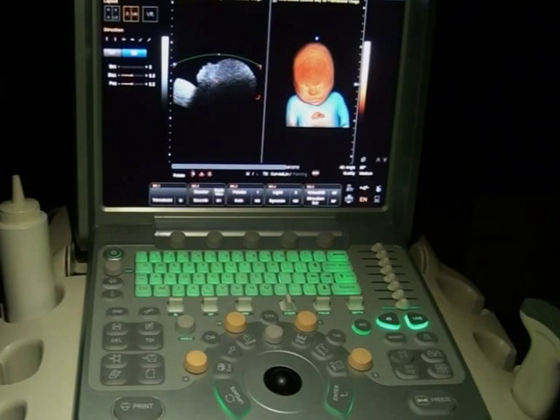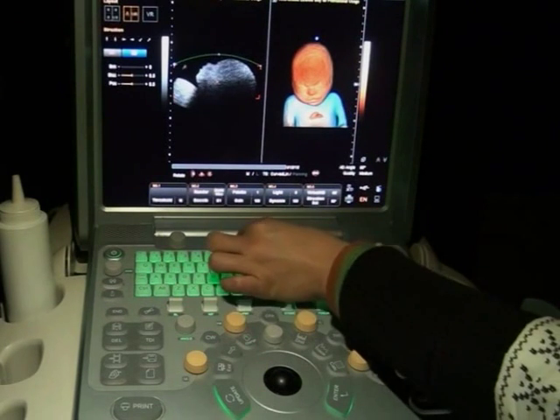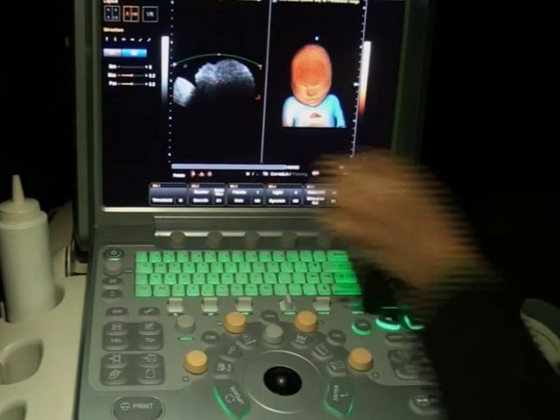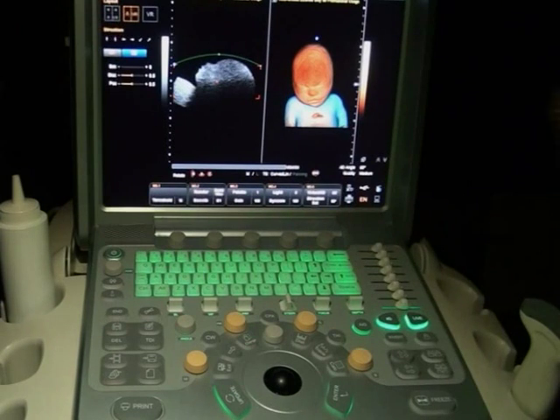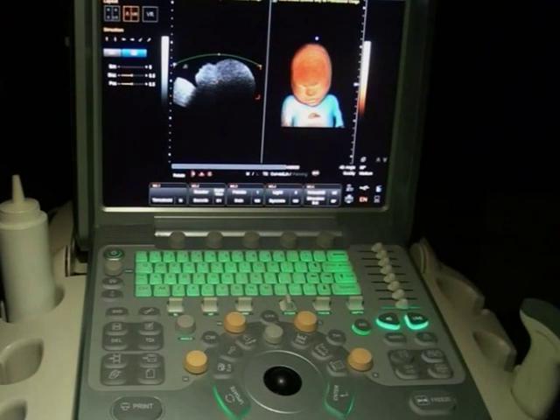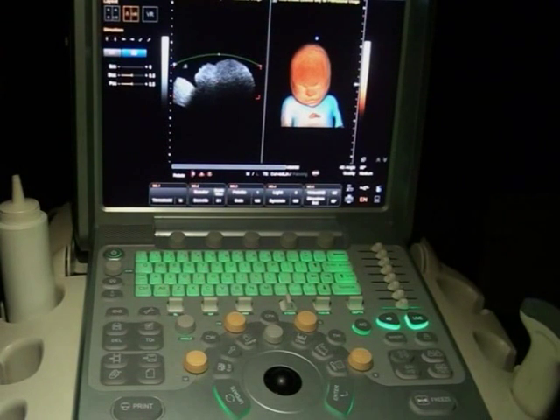For the 4D image, you can make adjustments to improve it. Rotate this knob to change the 2D gain, and this knob to change the 2D dynamic range. However, we suggest that if it is not necessary, please keep the default values.